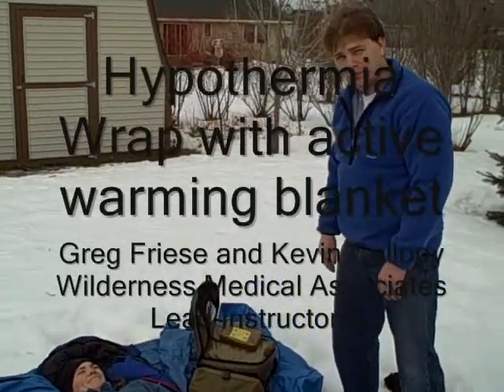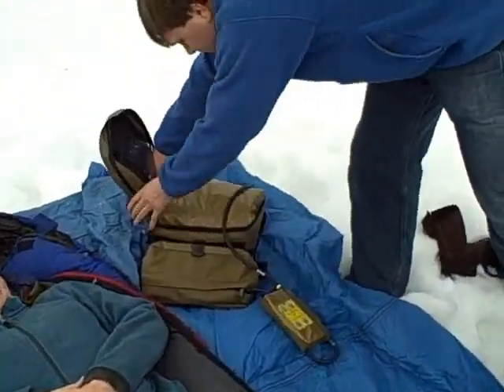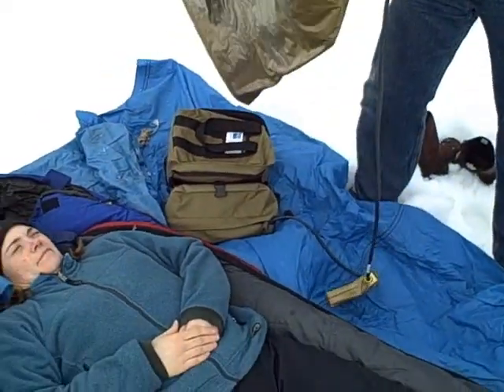This time we're going to add something extra to our HypoWrap. That's Kevin, Amanda, and I'm Greg. What Kevin's done is a mini Rescue Foreman Blanket from RG Medical Diagnostics.